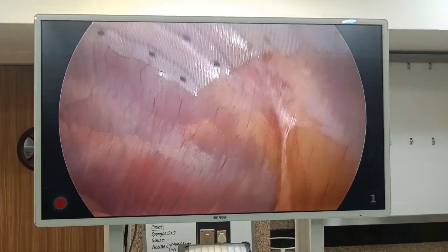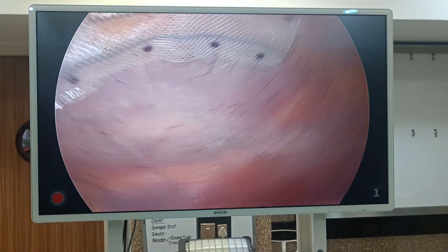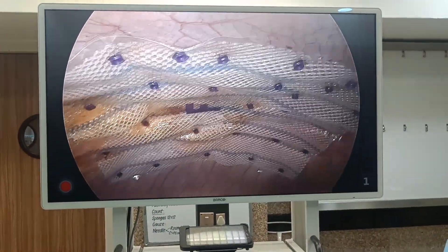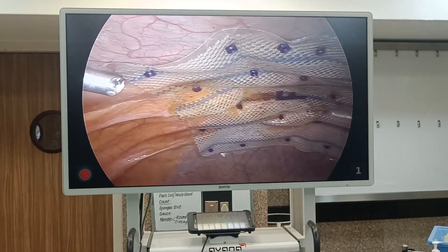I will show you the anatomy as well. This side is towards the liver, and this is towards the pelvis side. This is a 15x15 centimeter mesh, completely flattened into the abdominal wall. This is the IPOM Plus laparoscopic method of umbilical hernia repair.